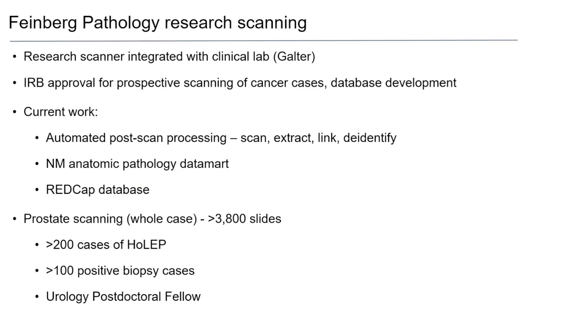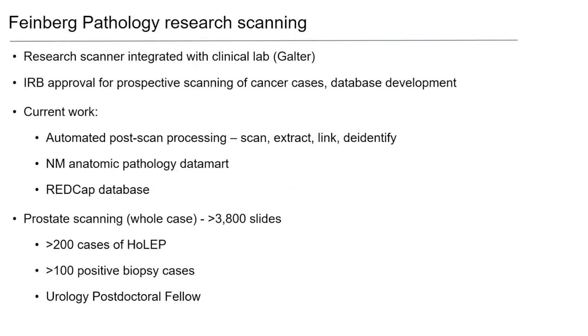And if they're trying to plug that into the rest of how we use the EDW, which is our electronic data warehouse of EMR, so we can sort of feed forward almost in the background as we go through. And I think almost all of our staging right now has a synoptic reporting that pathology does, and so those are all queryable fields. So you could imagine it just happening in the background over a year, and the year finishes and we've got, whatever, like 40,000 pathology cases. Do you know anything about how that's going to work, or any thoughts?